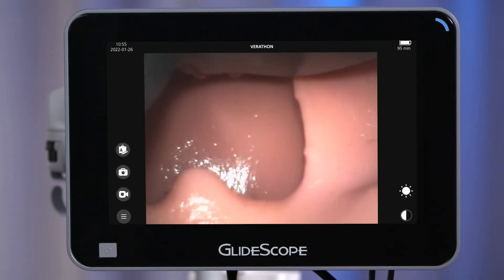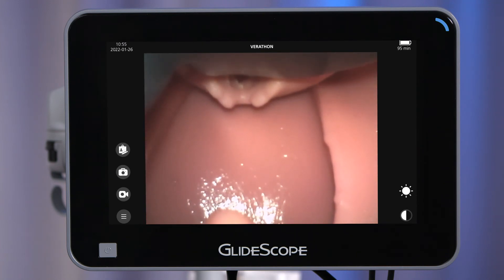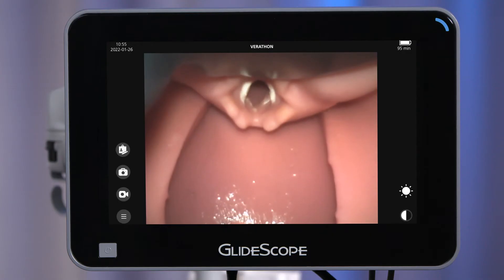In step two, look at the video monitor. While advancing the blade, identify the epiglottis and lift it with the tip of the blade in order to expose the vocal cords. Ensure that you do not position the blade too deep, which could result in partially obstructing the glottic opening and impede endotracheal tube insertion. Ideal blade positioning should be deep enough to manage the epiglottis, but not so deep that you lose the advantage of the panoramic view that the camera provides.